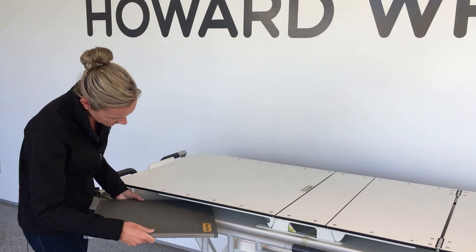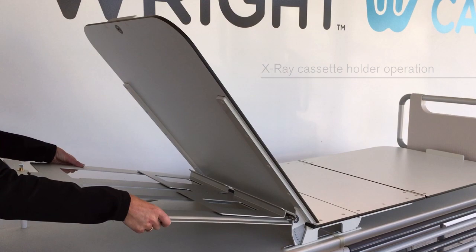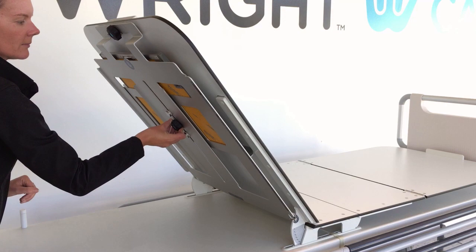The M9 Trauma has a full radiolucent deck. An X-ray cassette can be positioned anywhere on the lower deck. An X-ray cassette holder is also available, which attaches to the backrest. Simply locate the cassette on the pins at the base, place the cassette on the tray, and fix the cassette holder securely to the backrest with the handwheel. The cassette can be adjusted up and down using the handwheel.